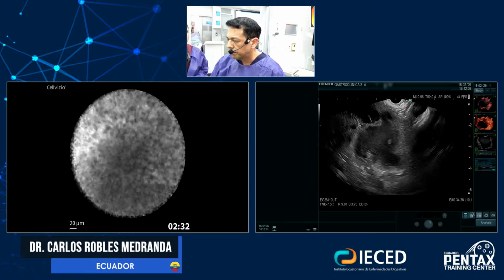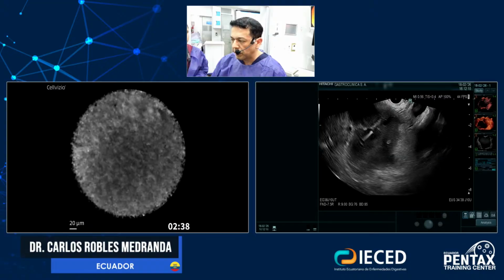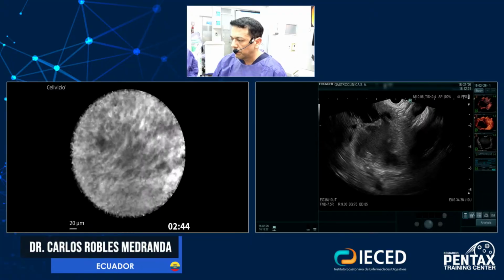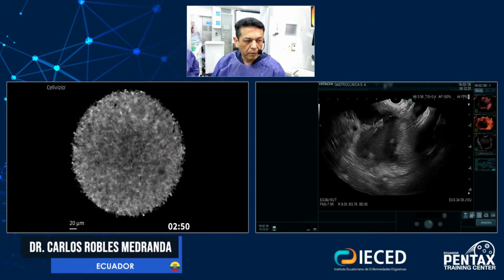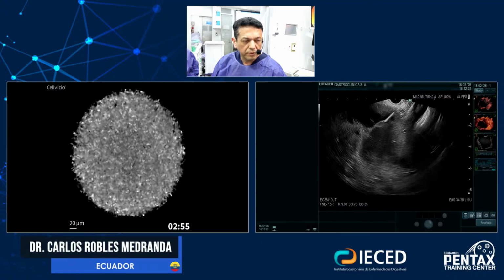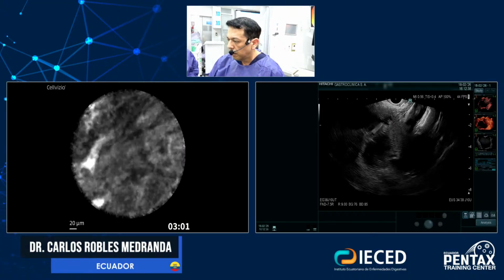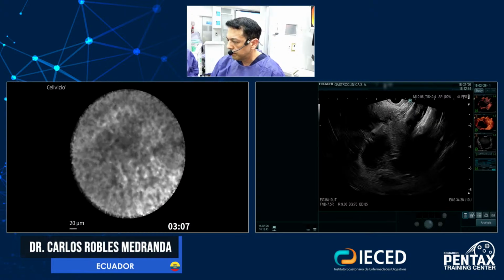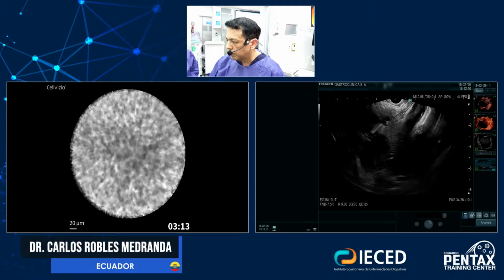Yeah, I believe yes. This patient doesn't have pain, doesn't have any other clinical characteristics, so probably it's not a functional one, but it's a big one. It's almost 6 centimeters. This was detected just because of blood. This is the wall.